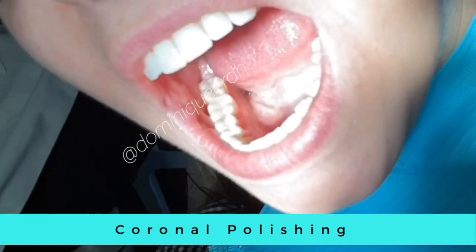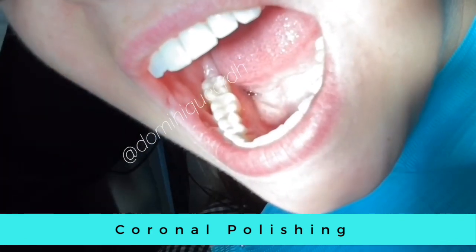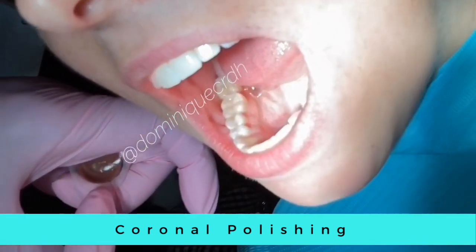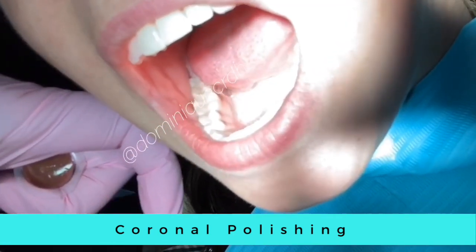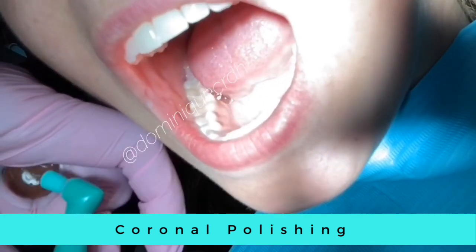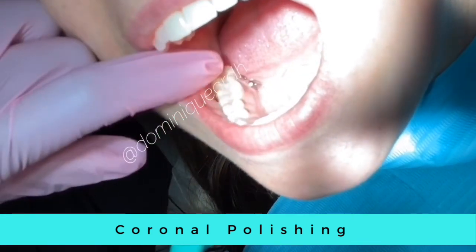Have the patient open and I typically like to hold my polishing paste in my hand wrapped around my middle finger. I'll take the profi angle and just load it, then we'll get started with the treatment of polishing the teeth — just load the profi cup and retract.